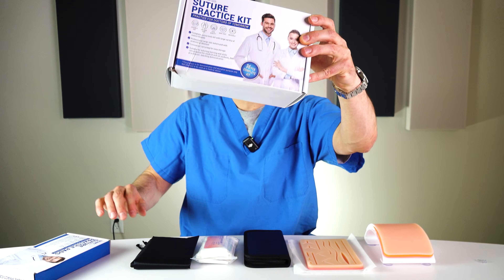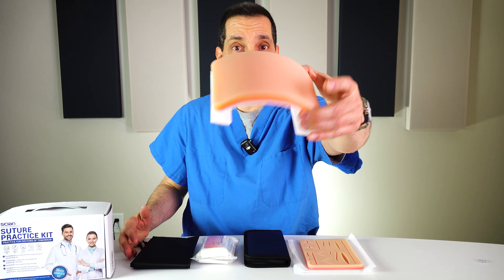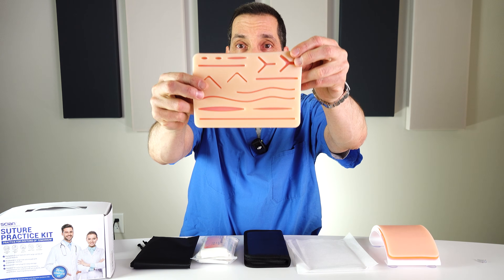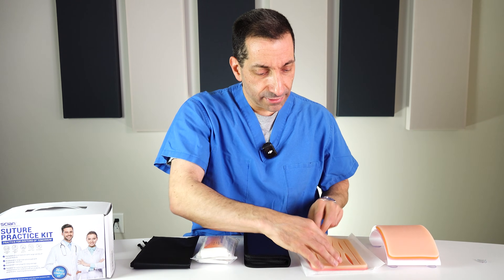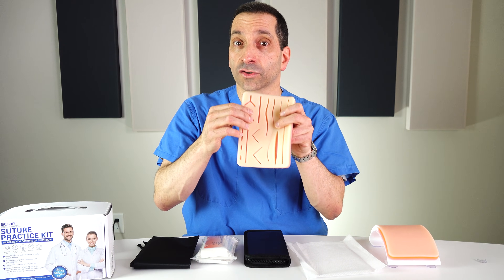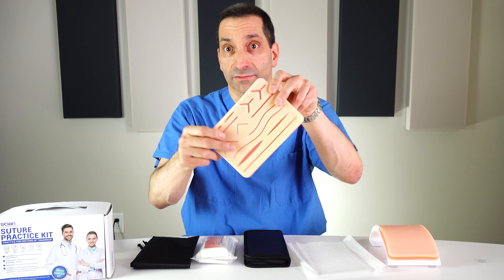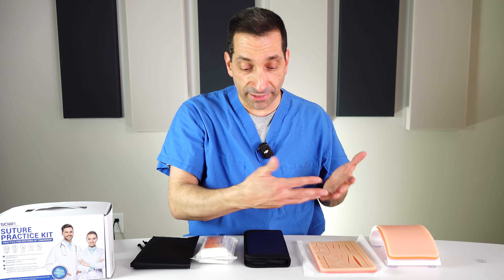The bigger kit comes in this box and is $27 — I'll put links down below. It comes with everything you see here: a curved pad where you make your own cuts in whatever shapes you want, with suction cup feet on the bottom to keep it stable. It also comes with a pad with 14 different pre-made cuts. The skin on this pad is definitely better than pig's feet, and if you can get used to suturing on these, human skin will be easier because it comes together better. You can reuse these many times — put the stitches in, cut them out, and keep repracticing different techniques on different wound types.